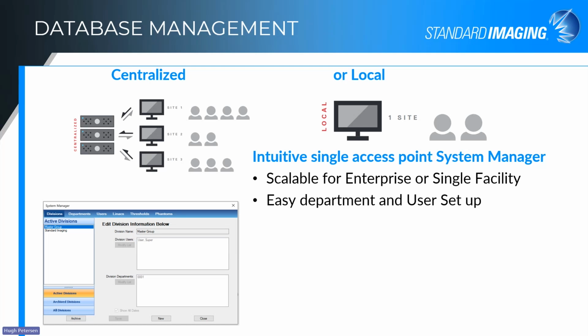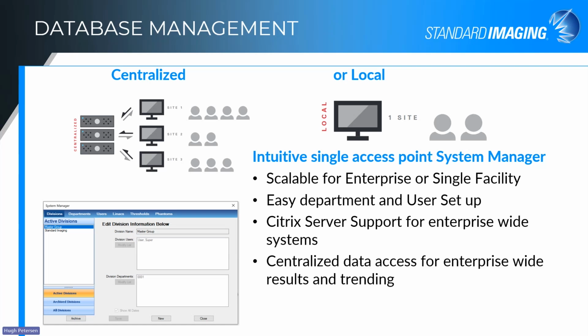There's an easy department and user setup, and I'll touch on that in a little bit as well. We have a system manager, as you see in the lower left, that helps you set that system up, and once it's set up, you're good to go. You don't have to keep going back into things. That makes things very easy to track and set up for your facilities. Citrix server support for that enterprise-wide system capability.